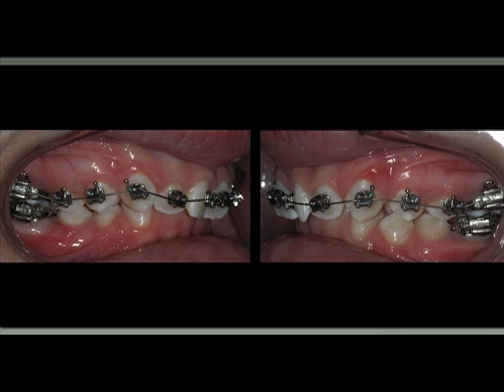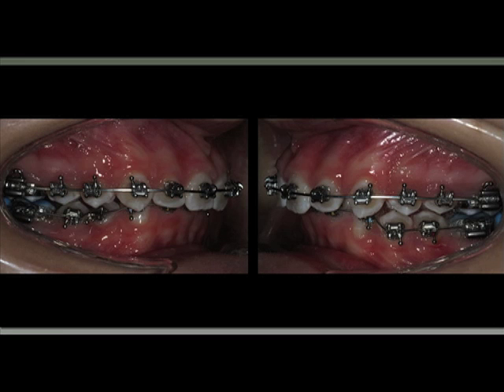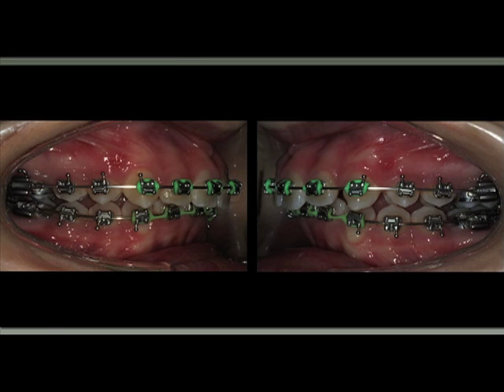So I'm just gonna drive you from this wire to this one when we have a stainless steel in the upper, and we have everything level and aligned, and we have the lower appliance just built, just placed in. We open the bite with stops, blue composite stops in the molars, just to open enough so the upper teeth will not be touching the lowers. And then we move the lower wire, all the sequence, up to a 19 by 25 stainless steel.